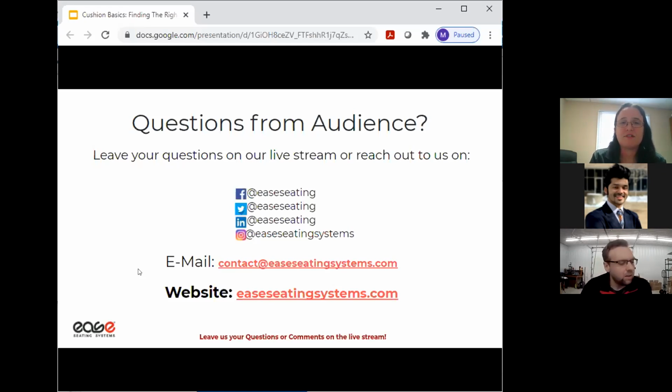Okay. And let's say you need a more specialized cushion, who would you talk to? I would recommend talking to a seating professional. That way you're getting as much information as possible on cushions, and they'll help you choose what might be best for you, help you to try different cushions. That way, again, you know what's going to work.